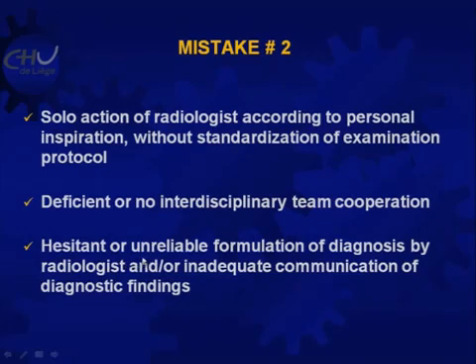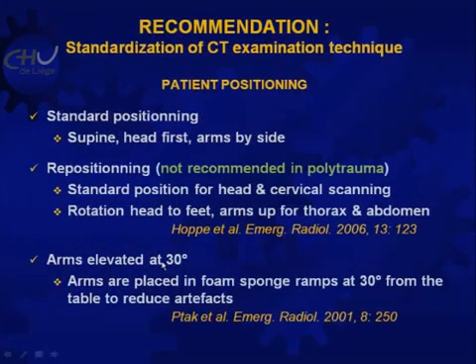Extravasation, does it mean that the patient has ongoing bleeding now, or do you just see extravasation but the patient is not bleeding anymore, clinically speaking? It's just one of the problems where the vocabulary has to be defined in agreement with the entire team. So I go on with my recommendation concerning standardization.